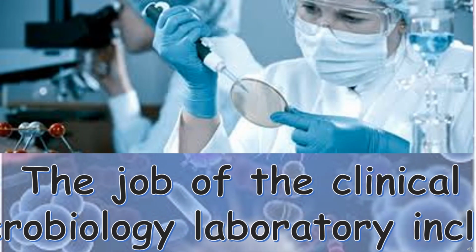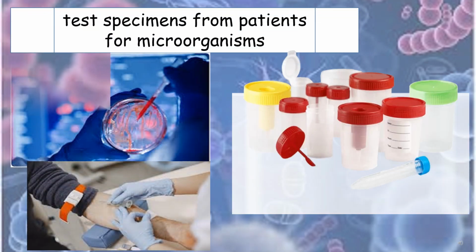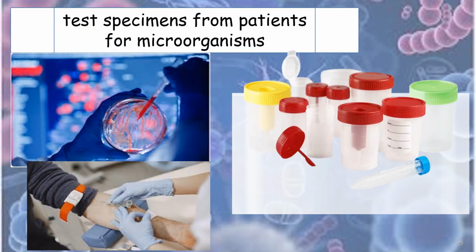A microbiology laboratory is a laboratory devoted to the culturing, examination, and identification of microorganisms including bacteria, fungi, yeasts, etc. The microbiology laboratory has a crucial role in effective infection prevention and control, IPC. The jobs of the clinical microbiology laboratory include: to test patient specimens for microorganisms.